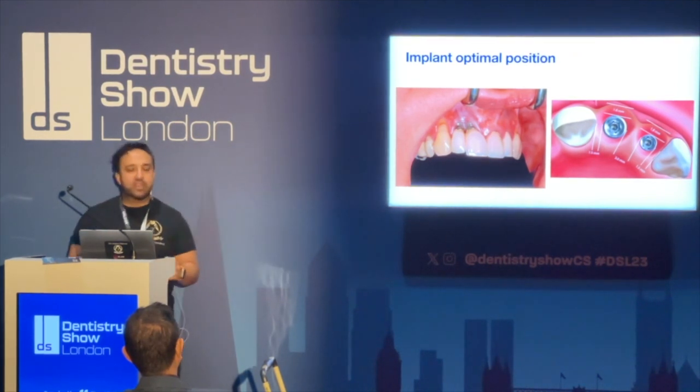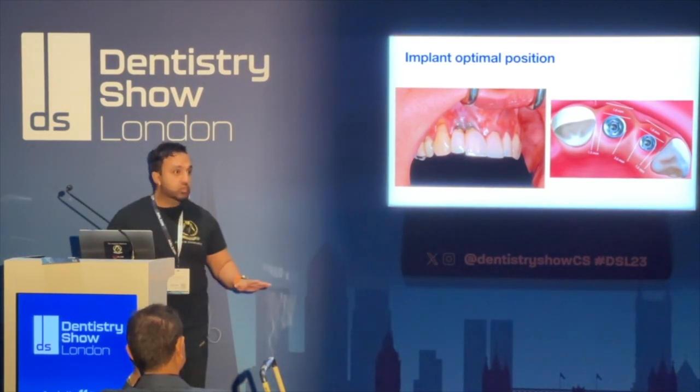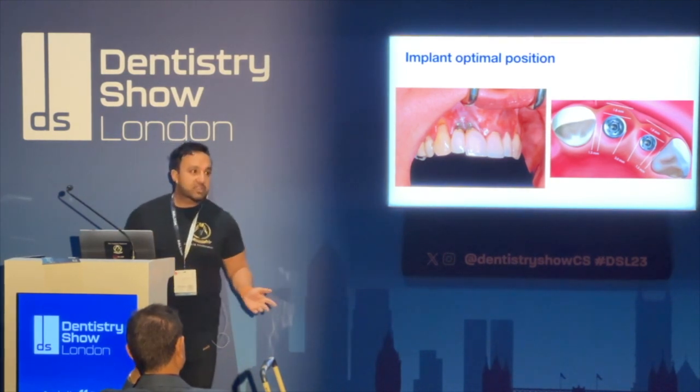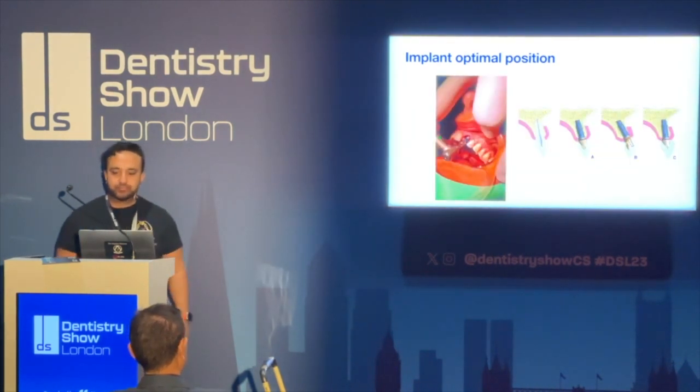And don't always dive into, let's take these out and start again. Because taking implants out is quite traumatic. You lose a lot of tissue. It's a full invasive surgical procedure, and you may not need to do that. Okay, so optimal implant position.